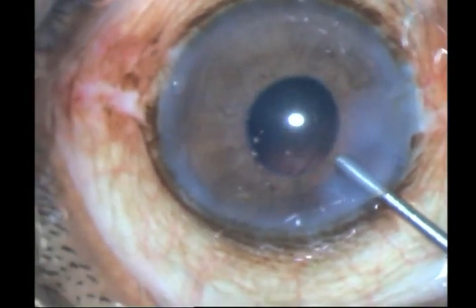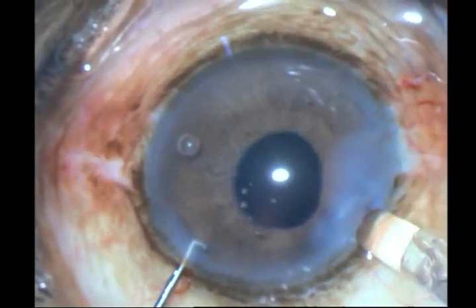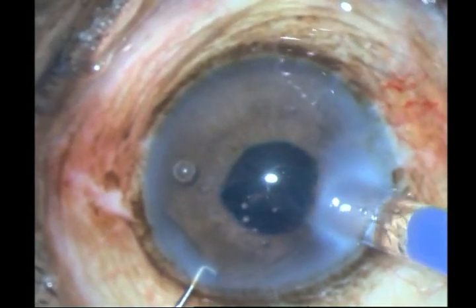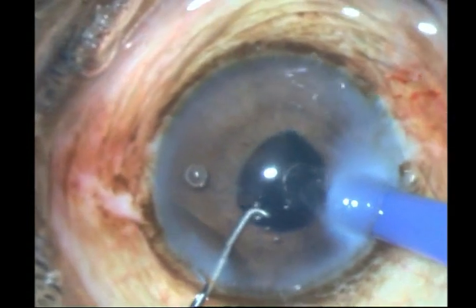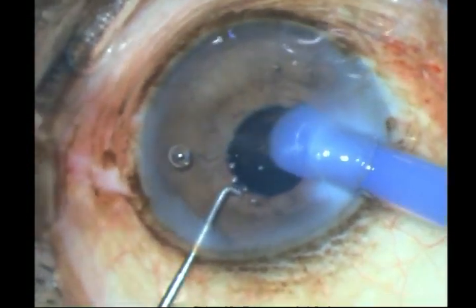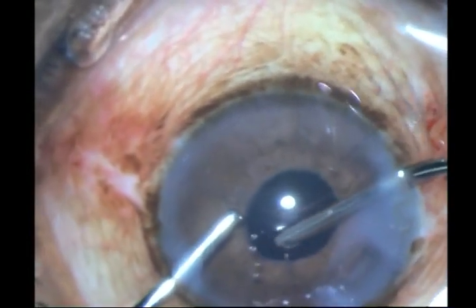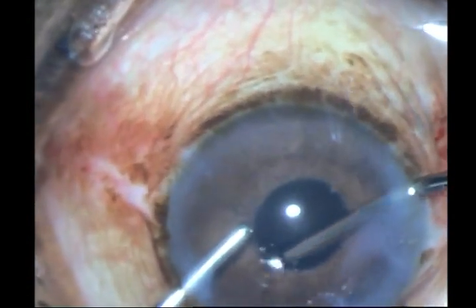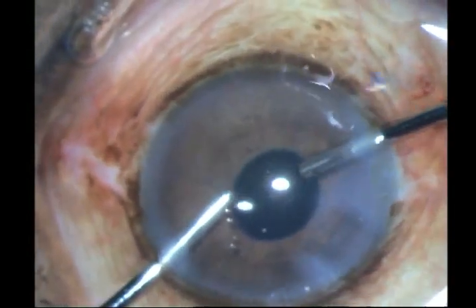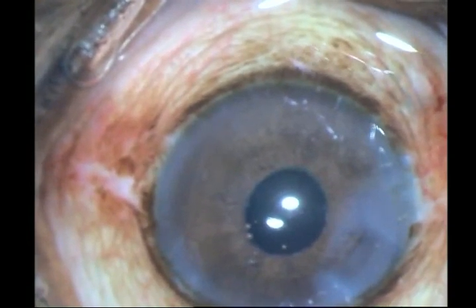Once done, I put in HPMC and then make sure I inject my foldable IOL right within the bag. If needed, you can extend the incision a little bit — it has to be in-the-bag delivery, not a wound-assisted delivery in such a case. With the implantation of the IOL and some rotation, some cortex can get picked up, making it easier to take out those bits and pieces. There doesn't seem to be any here, and with this I conclude my surgery. Thank you.